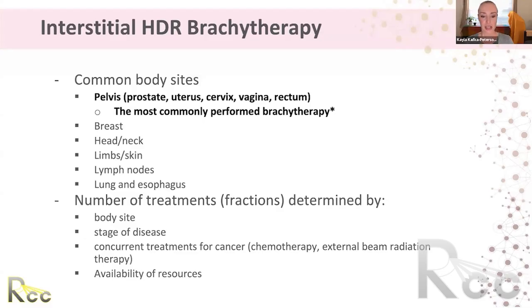Some centers, especially in areas where patients have to travel very far, a lot of the centers I've been working with throughout Africa, I know patients come from sometimes even other countries because they don't have brachytherapy where they are. And so their fractionation sometimes is a mix of literature as well as what resources are there, how long can the patient be there, do you give it in 2 fractions, 3 fractions, 4. So you will see variability based on team, region of the world, and what is being treated.